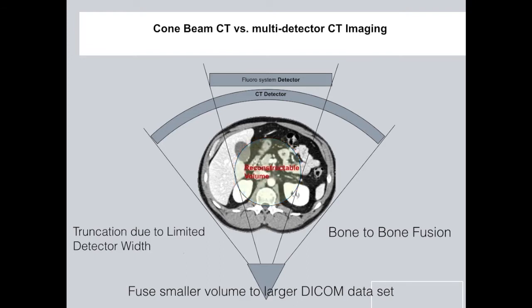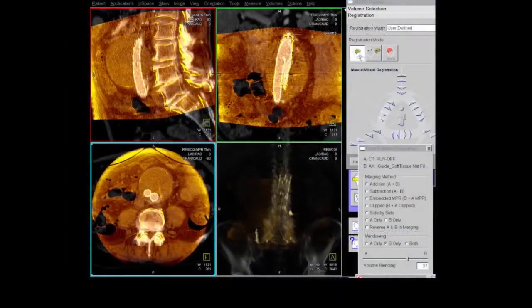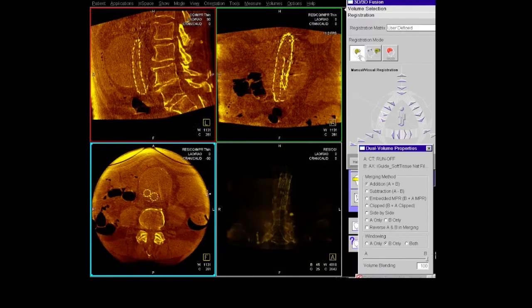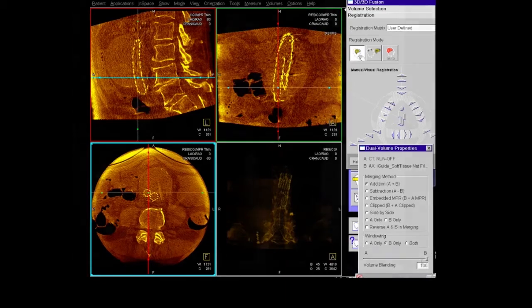The truncated data set does allow us to fuse that area on the previously acquired CT scan. This is generally a bone-to-bone fusion, and once the fusion has occurred, this allows us to register the entire previously acquired CT data set. These two data sets are then merged on the workstation — the two different colors represent the cone beam CT and the previously acquired CT scan — and you can align both the bones and, in this case, the endograft to ensure accuracy of image fusion.